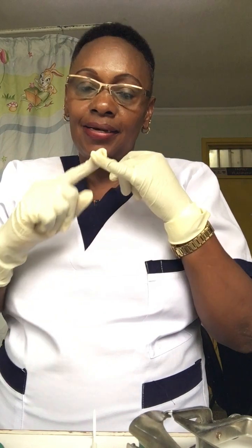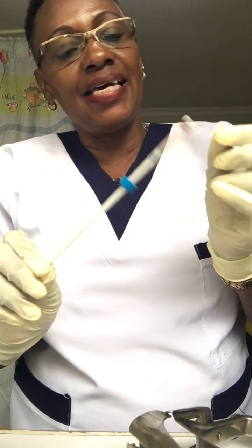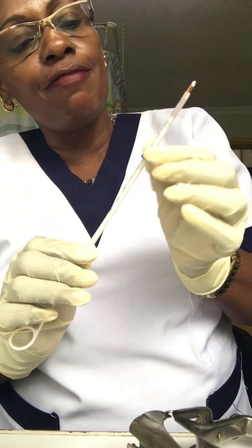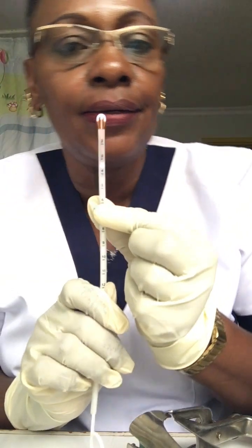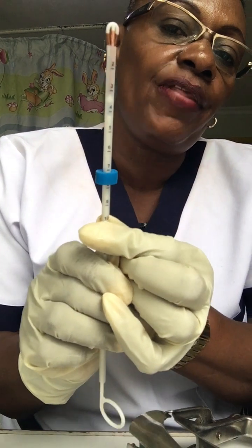Before this insertion is done, we have to measure the size of your uterus. If it is below 5 centimeters, we cannot use this because it will just come out after some time. And if it is above 7 centimeters, still we don't insert. This is the 5 centimeters. That shows that you have a short uterus. And if you have a long one, still this method doesn't suit you. These are the readings there.